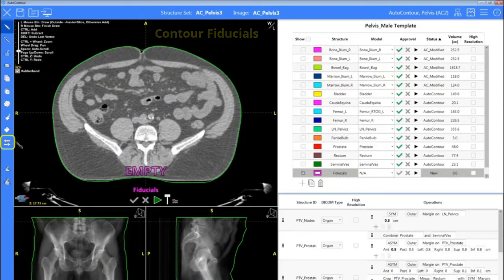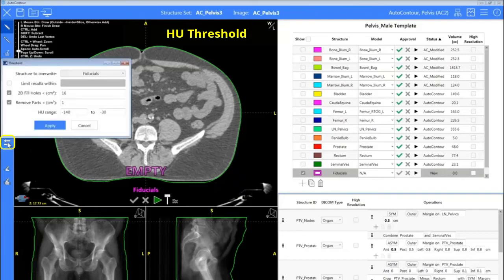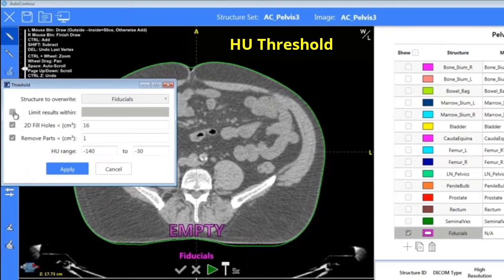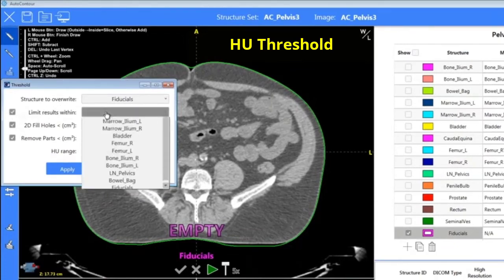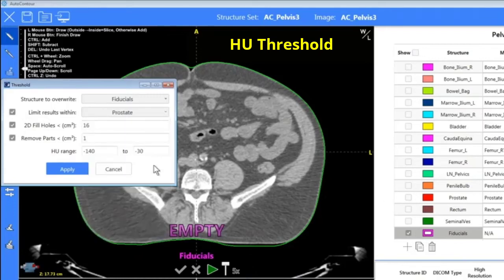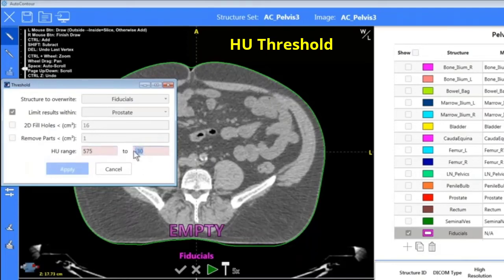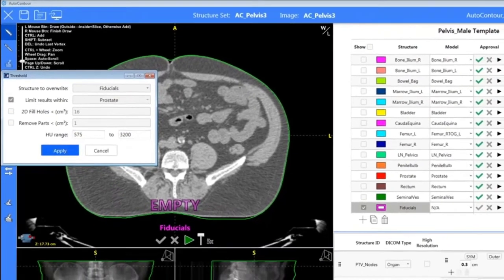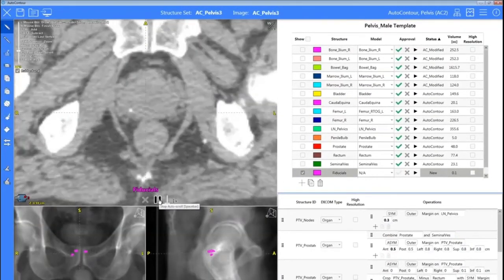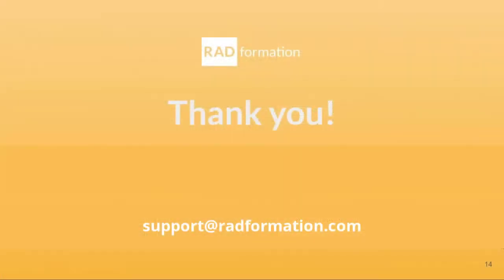We also have fiducials that we can contour here in auto contour. The HU threshold tool is over on the left. The structure to overwrite is what we're creating, and we can limit our results — I don't want to pick up that HU throughout my entire body, just within my prostate. We have the option of filling or removing parts, but I'll just set an HU range, hit play, and we see those are automatically generated for us. That's a deep dive into some tips and tricks and the new 2.0 tools.